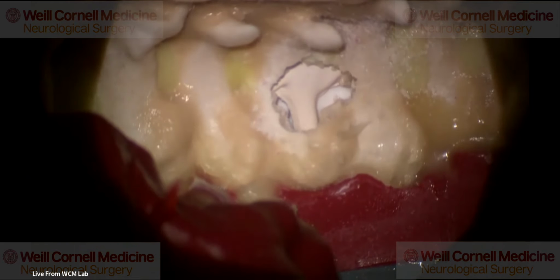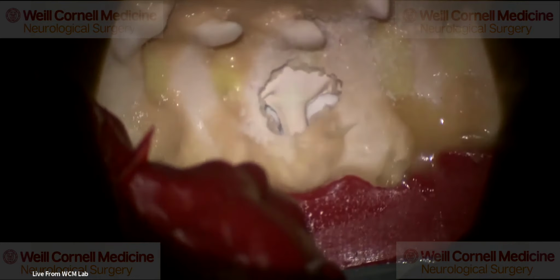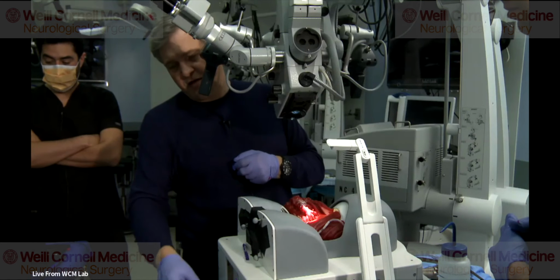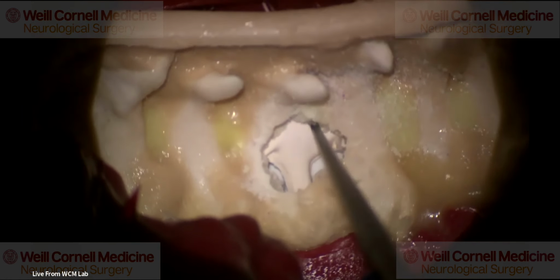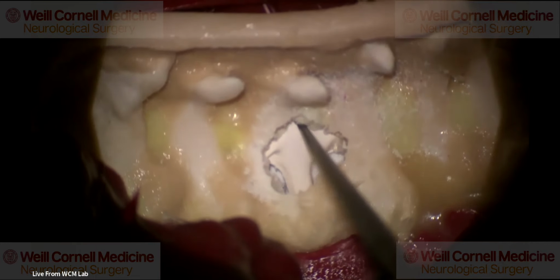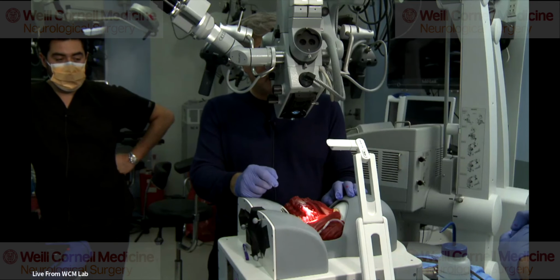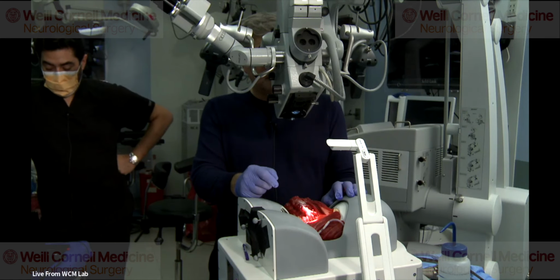And then you can also kind of see here that if you had cervical stenosis, just by angling your tubular retractor, you can see that. We've described that. We have a video published. We have a paper. We did that with Soriano. We published a paper on that from Mexico City. You can basically do like in the lumbar spine: you undercut the spinous process, take the ligament, and go all the way to the other side. You mean a unilateral approach for bilateral decompression? Yeah, it's possible as well.